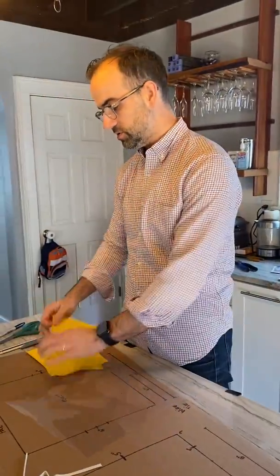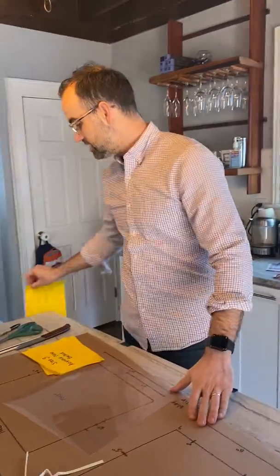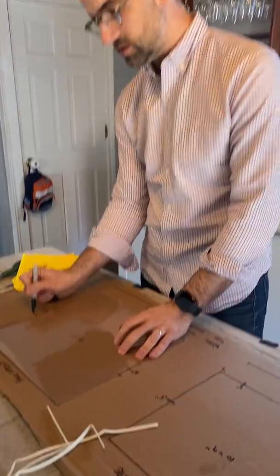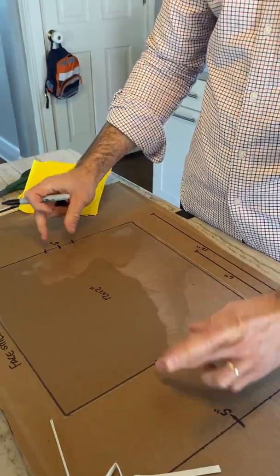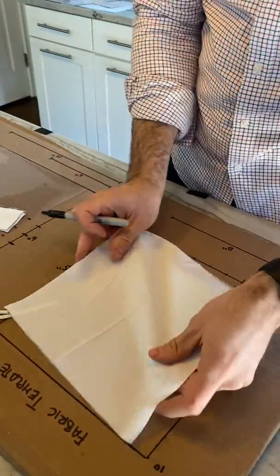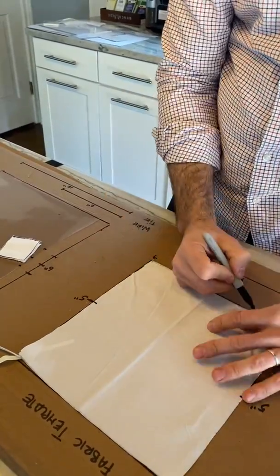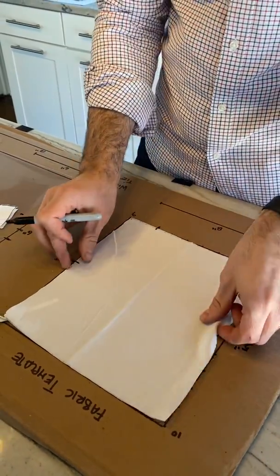Step two: mark stuff. The nice thing about having your template all laid out is it's very easy to mark your center points. Here I'm marking six inches on either side, which I will use to position the velcro later. On the actual mask I'm going to mark the halfway point on either side so I know where to fold it, and also two inches in from one corner so I know where to position the lower strip.